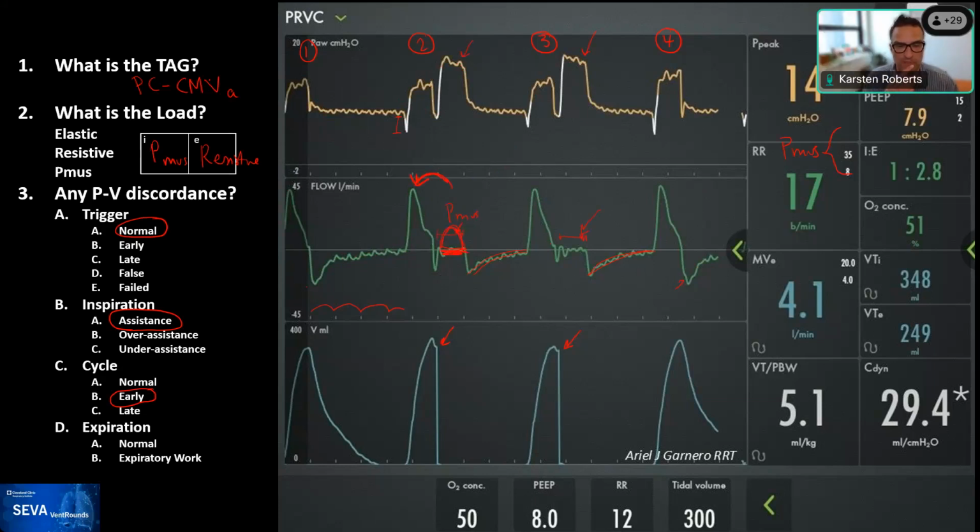Yeah, no, it definitely makes sense. And, as we're talking about it, I was thinking that this could potentially be a patient with COPD, like you said, that's bearing down, with hyperinflated lungs, and maybe has almost a resistance towards the breath going in, because the pressure, as somebody had pointed out, the P vent and the P must equal at some point.